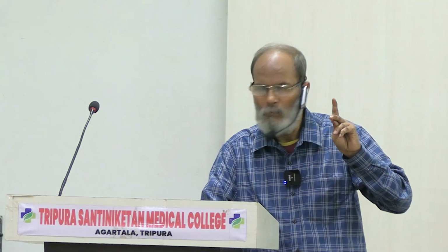In a healthy and stocky type of patient, the stomach is steer horn type. In others, it is slender. So after doing the X-ray, we need to see, number one, the position of the stomach, gas shadow, the lesser curvature, the greater curvature, the incisura, the pyloric antrum and pyloric canal, for the stomach only. So you need to know what the structures are and how this is to be followed.